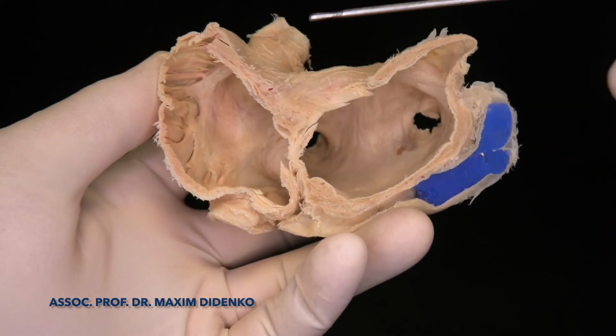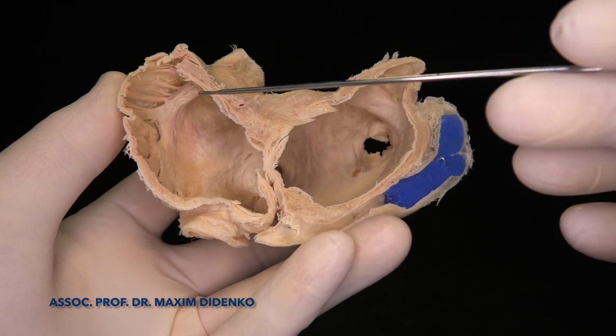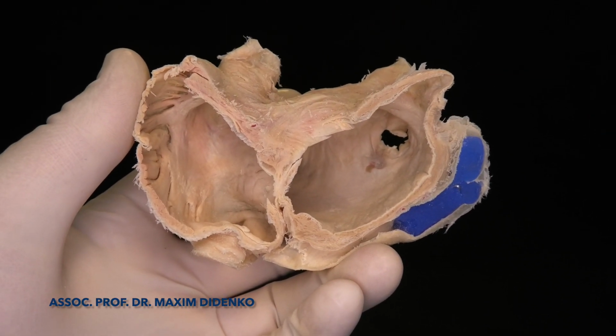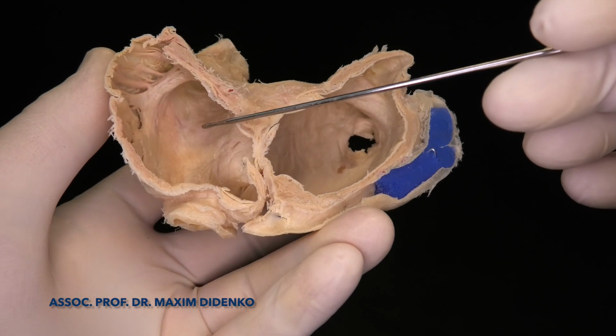We can see the atriums in LAO projection now. This is a right atrium, this is a left atrium, so this is superior, inferior. And then what we can see here.